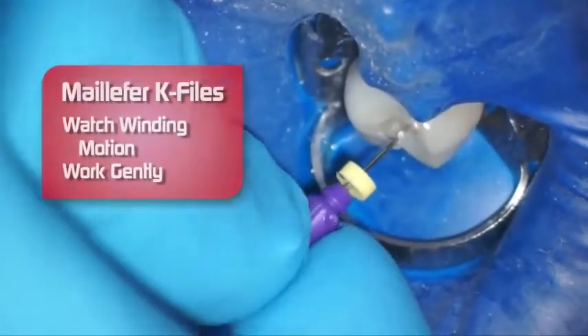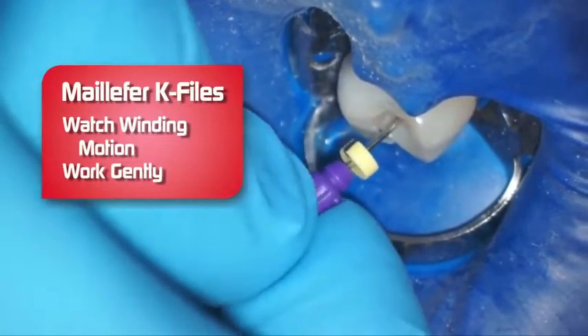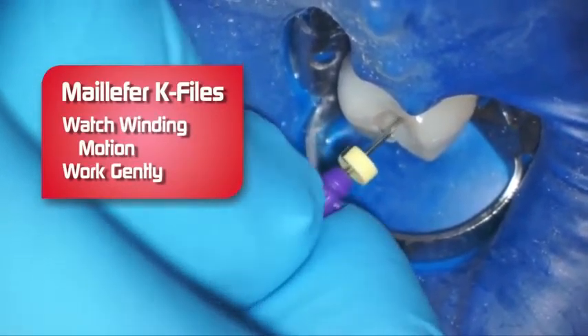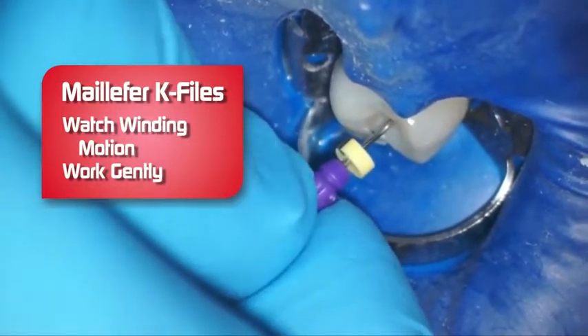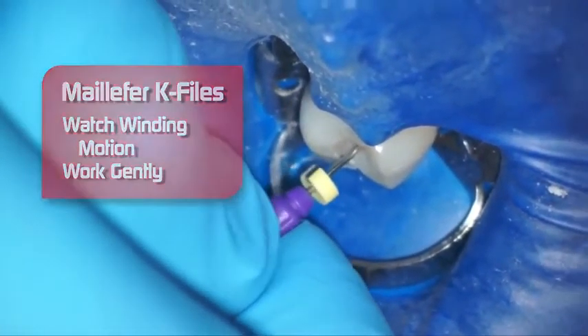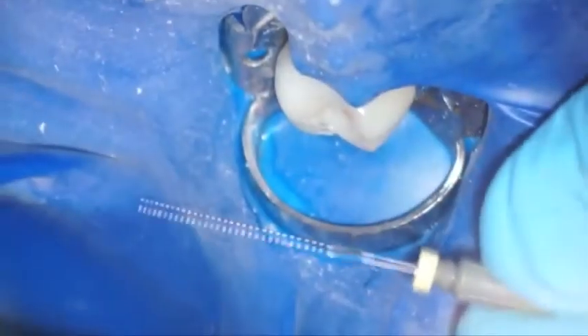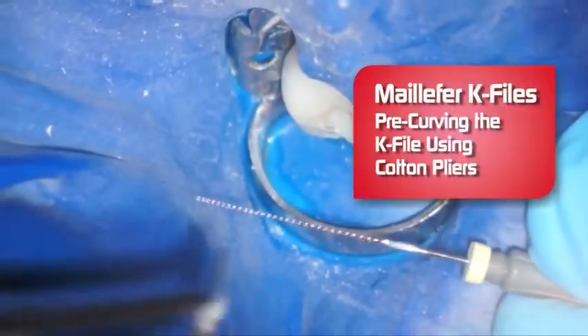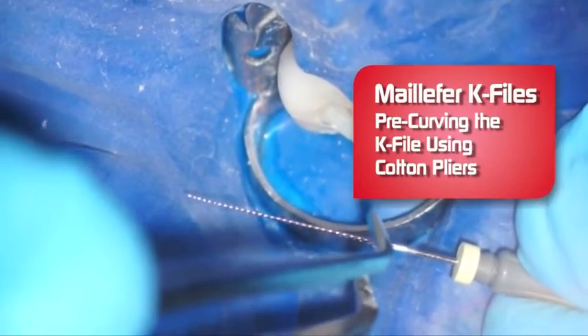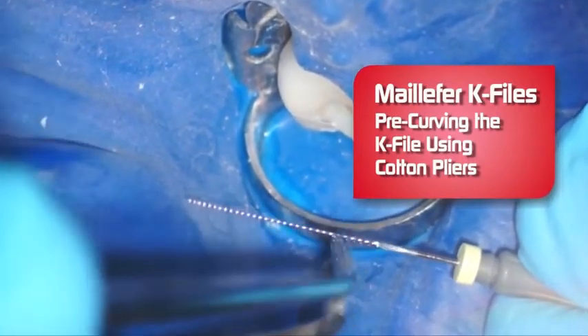In endodontics, you never want to force an instrument. I'm using a K-File with a watch-winding motion, just very gently. What I like to do with K-Files sometimes — this happens to be a number 8 — is pre-curve the file in order to get into a dilacerated canal like an MB2 canal.